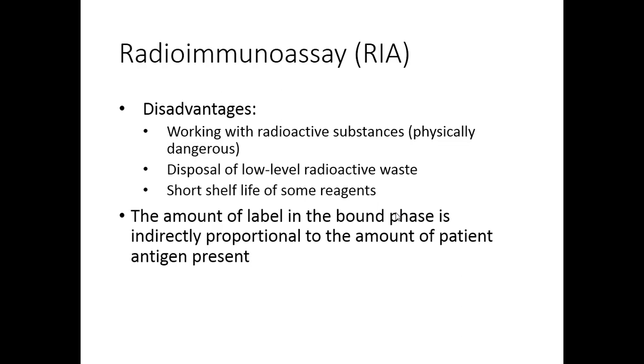But also, working with radioactive substances, having employees work with it on any routine level, you have to protect the patient, you have to protect the employees. Believe it or not, when they do this, with some radioactive substances, not necessarily I-125, patients may be involved with this. So, working with radioactive substances, not terrific. Disposing of even low-level radioactive waste is a nightmare. So all in all, a lot of disadvantages that ultimately, if we can, outweigh the ease of use of this test.